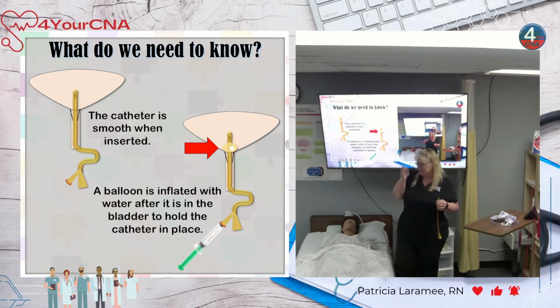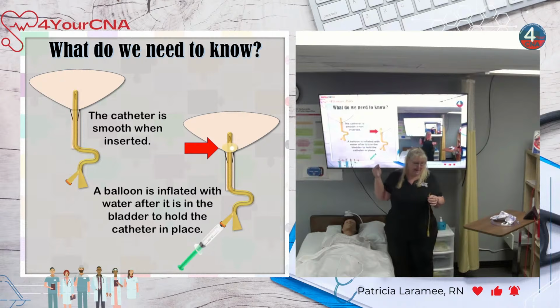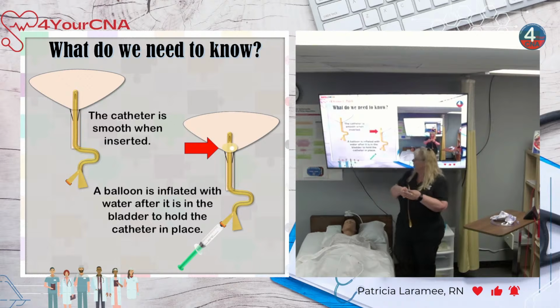So that's kind of the similarity between a catheter being put in and the earring, because it has to take up all of that space. It's going to be an irritation until you get used to it. Good, makes sense? But it should not hurt. If the patient says, "Ow, ow, ow, it hurts," that's something different. That's actually not because of the catheter itself exerting pressure. When patients say, "Ow, ow, ow," and they're in real pain with a catheter, what's happening is not here.